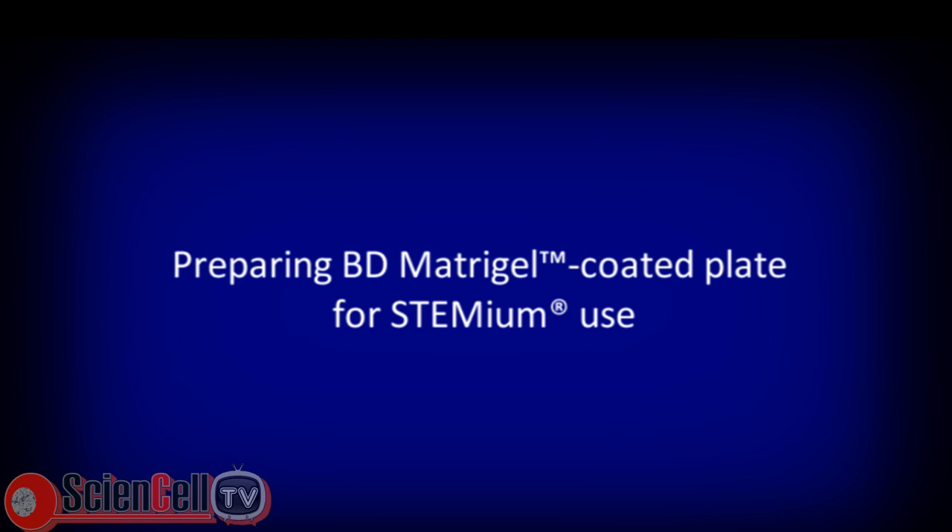In this video we will demonstrate how to prepare BD Matrigel coated plate for feeder-free culturing of human pluripotent stem cells in Stemium. It is important that users become thoroughly familiar with the entire method before proceeding.